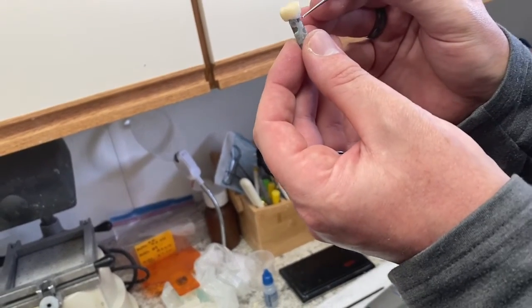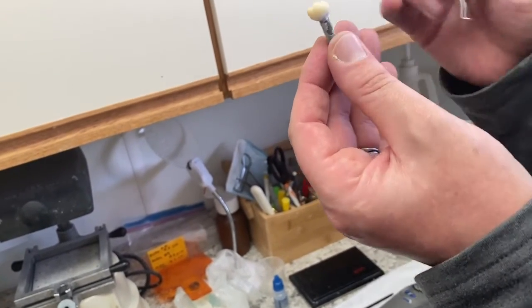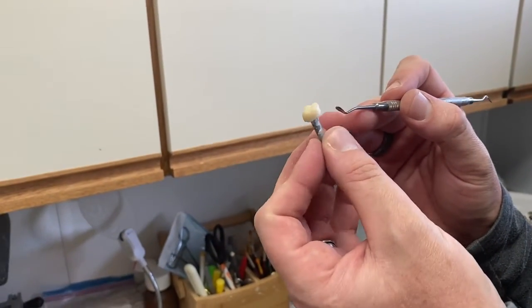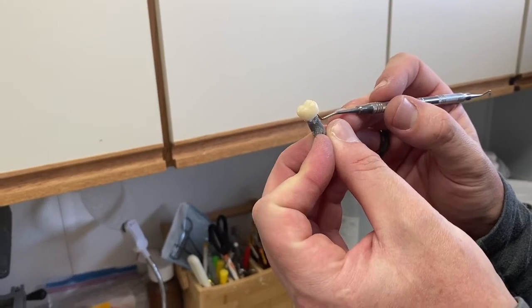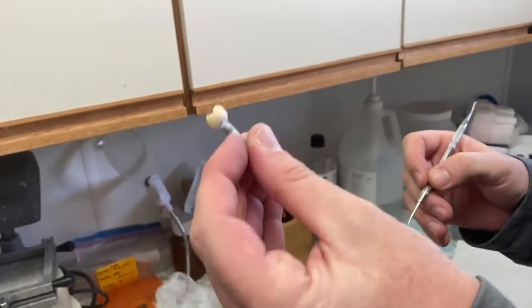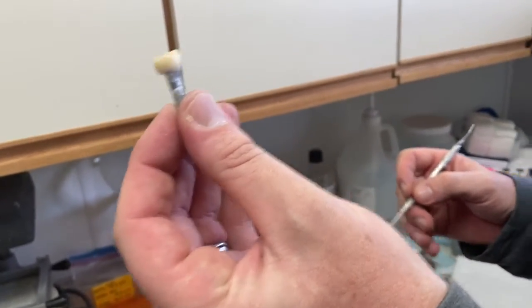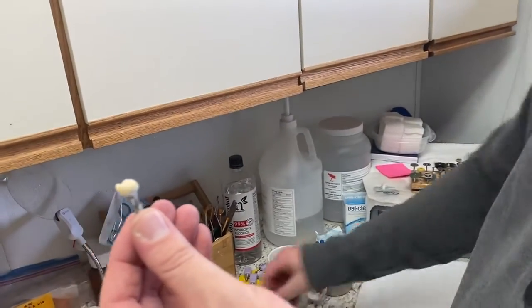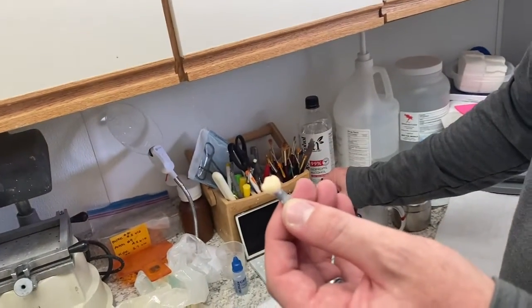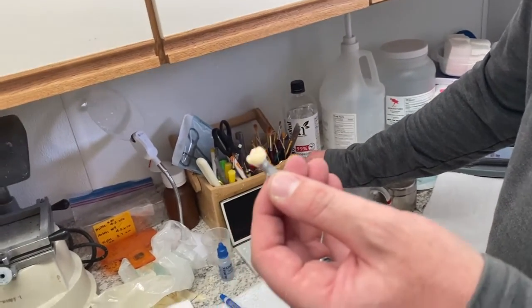So it's almost like, have you ever seen that kids putty stuff? It's called moon sand. It's kind of like that, but it's almost sandy. So he's just removing excess. And now he's going to use a brush with glaze, and you just go in one direction and down. Because if you lift back up, you're going to grab that material. So you just go down.